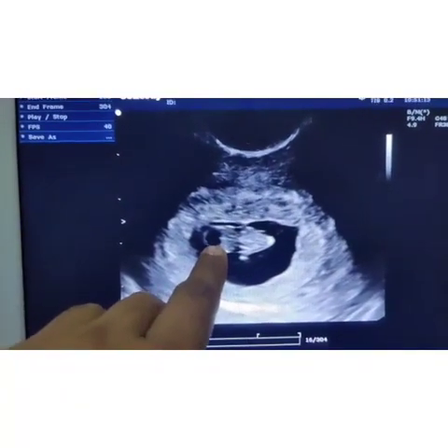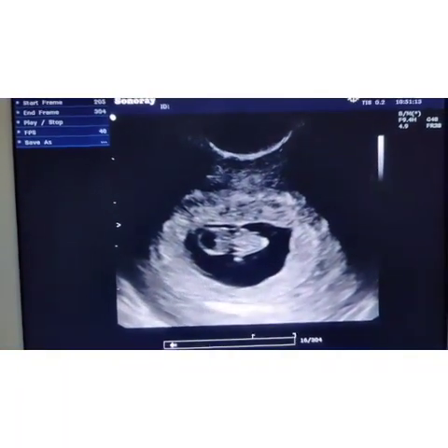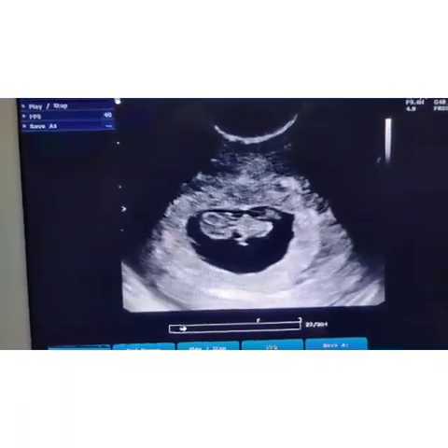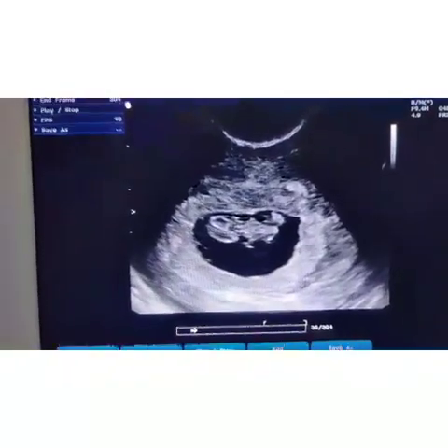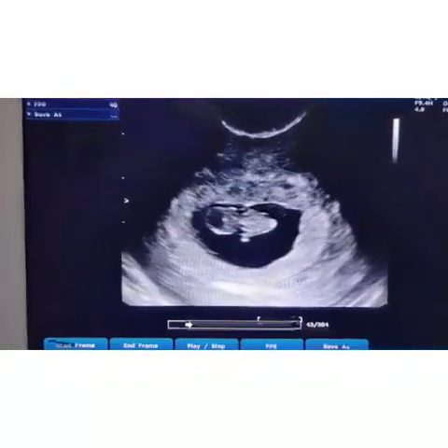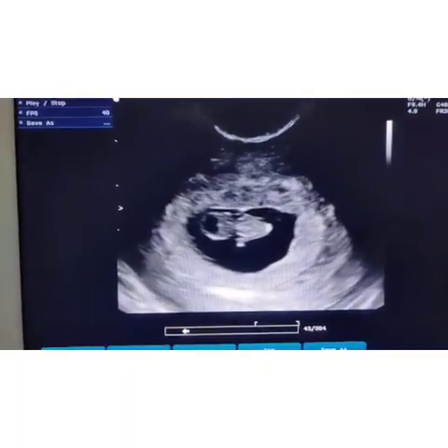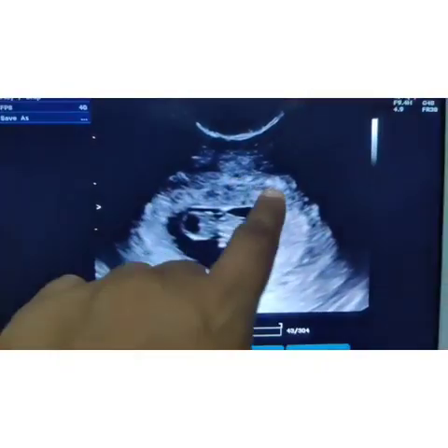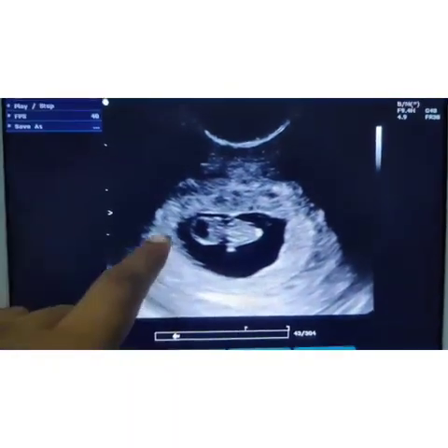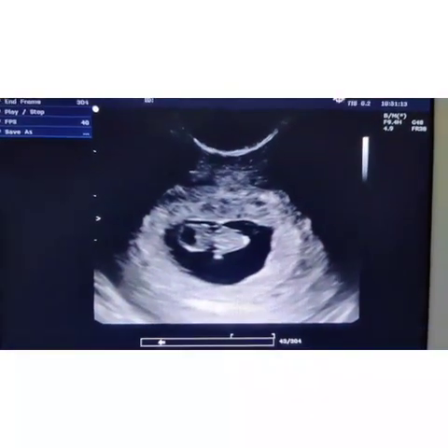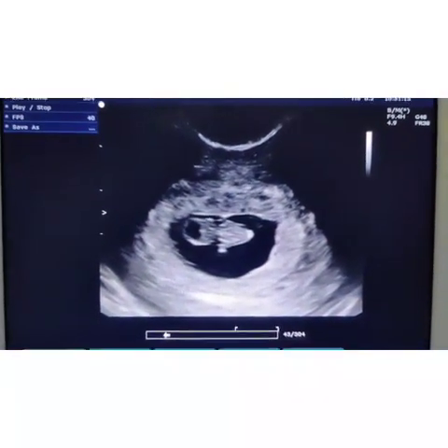The cystic structure on the head of the fetus is the rhombencephalon — a normal brain structure. This video is about the decidual reaction. Look at that good double decidual reaction. Thank you.